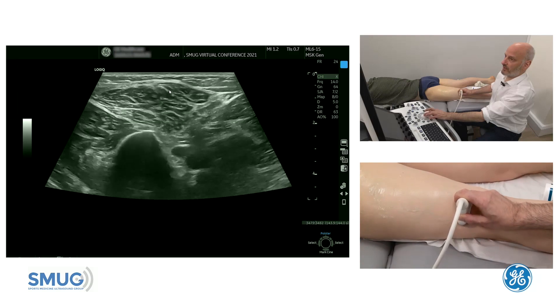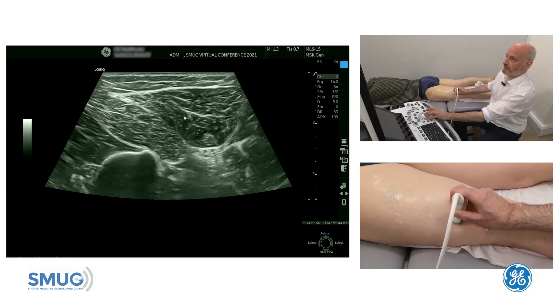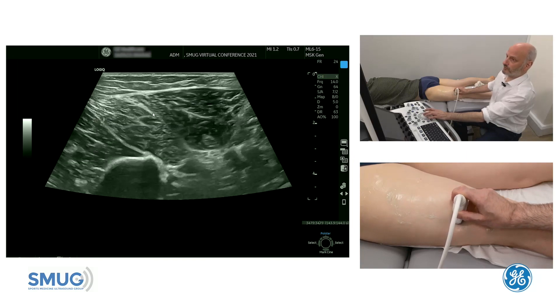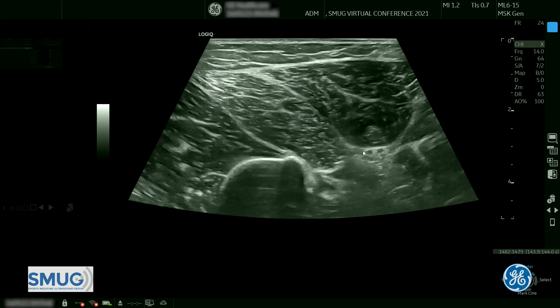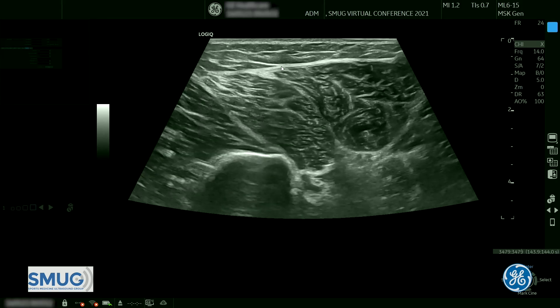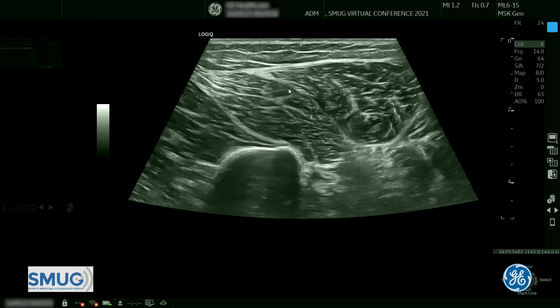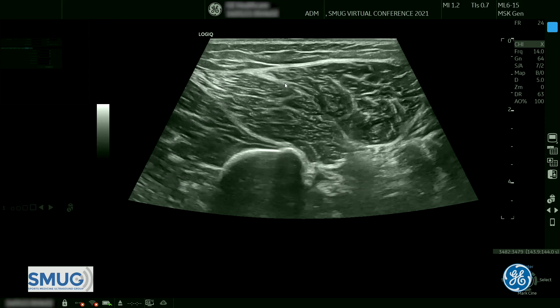When I go back up a little bit, the long head of the biceps is still a bit bigger, and we have a nice picture of the short head with the tram lines. Here is your sciatic nerve on the posterior side as a landmark as well. That's the area where you start looking for T-junction injuries — this is the anterior fascia, and then that is the compartment line between the long head and the short head, and the tendon area is there. That's where we look for all these T-junction injuries.